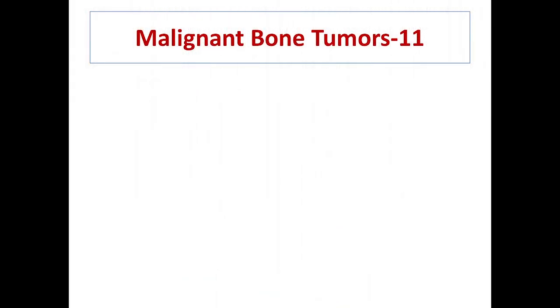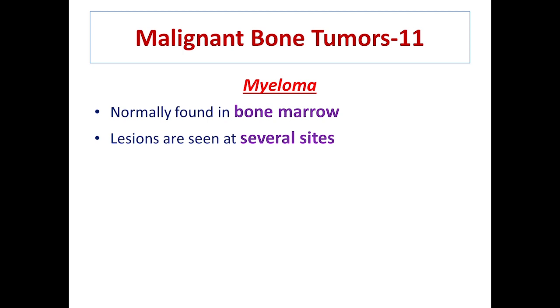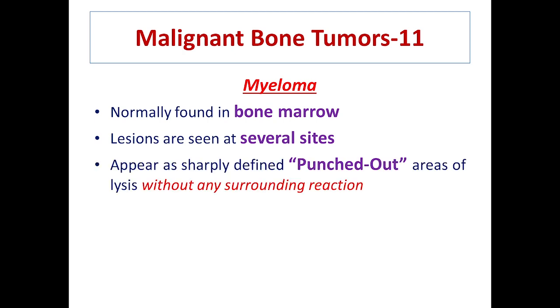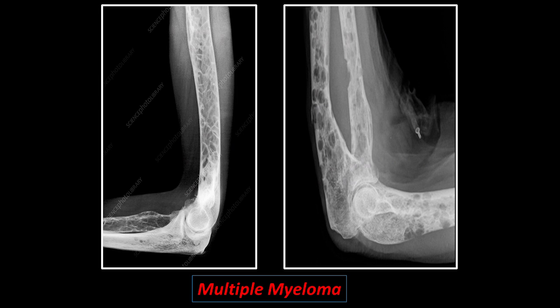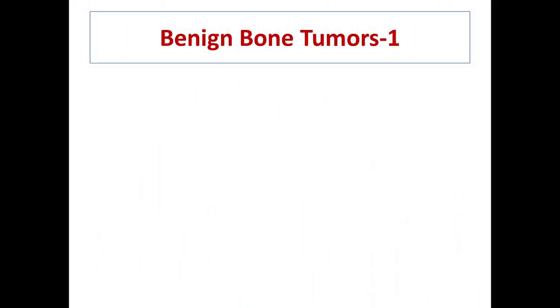Myeloma is a tumor of myeloid cells, which are precursors of RBCs and WBCs present in the bone marrow. Lesions are seen at several sites, and pathological lesions appear as punched-out areas of lysis without any surrounding reaction. In this radiograph, multiple myeloma in the bone marrow of the humerus, radius, and ulna can be seen, with very clear punched-out areas of lysis.